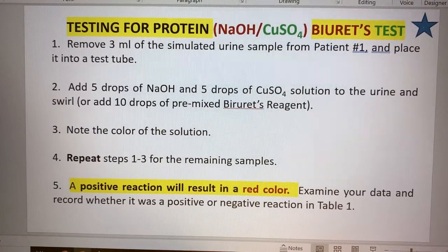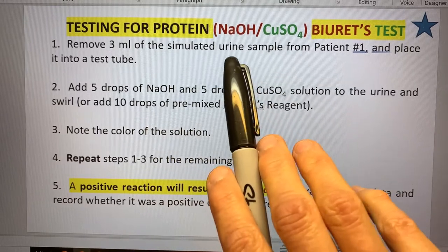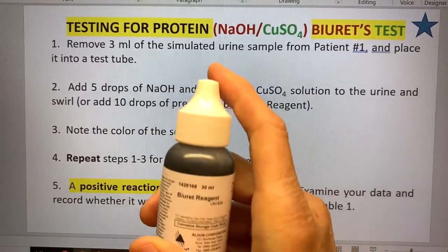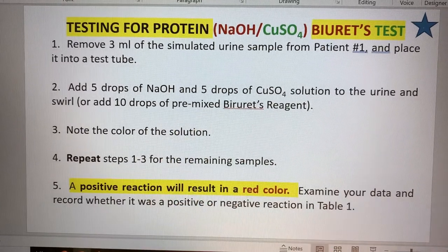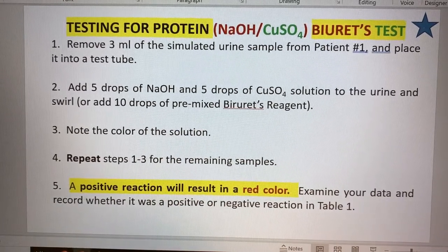Okay, so now we're going to perform the Biuret test for protein. Note that the way to make Biuret reagent is sodium hydroxide with copper sulfate, but we're going to use a pre-made solution already. So instead of doing 5 drops of each of these, we're going to add just 10 drops of the Biuret into the urine.